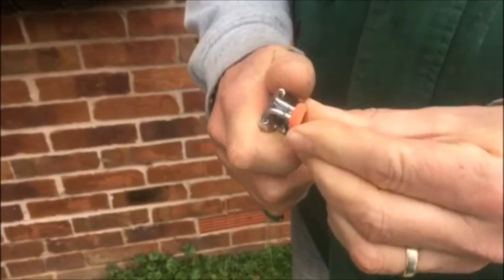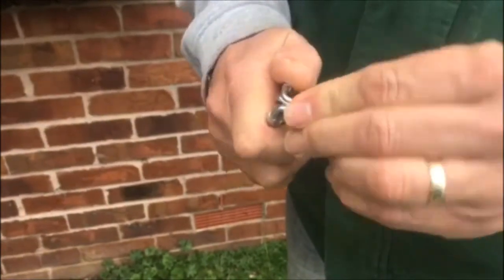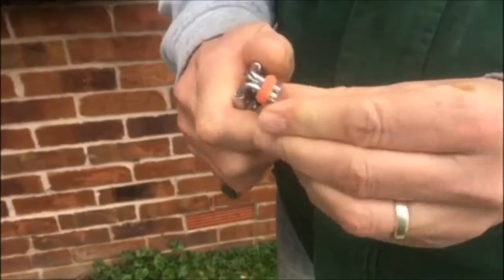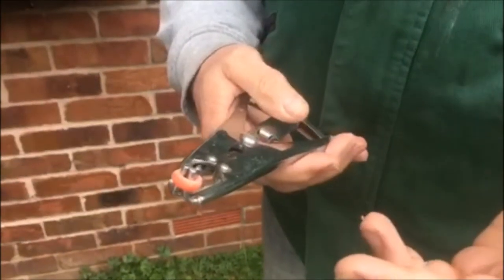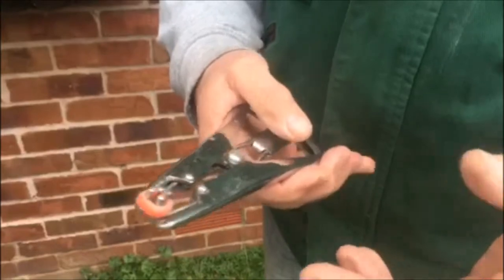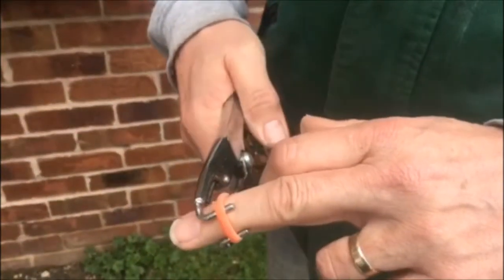It fits on the end like that, you push it down onto those little rings at the bottom, and then that's ready to go. Then you get your lamb and if you're doing its tail, you open them up, slide its tail through, let it go back, and then pull it off — the ring remains.